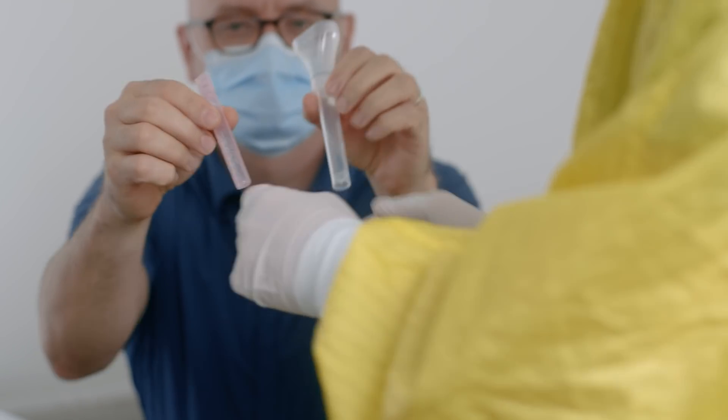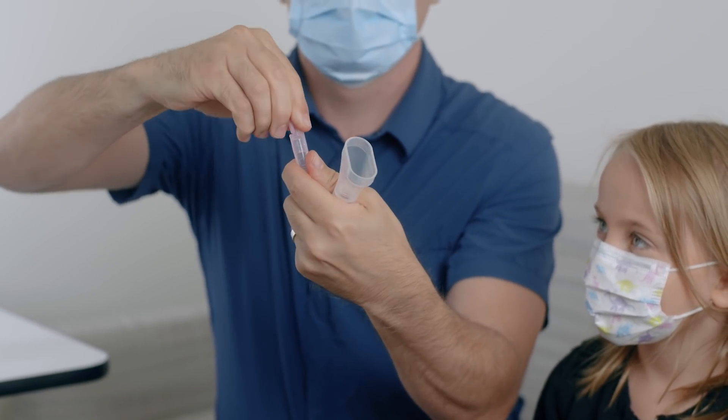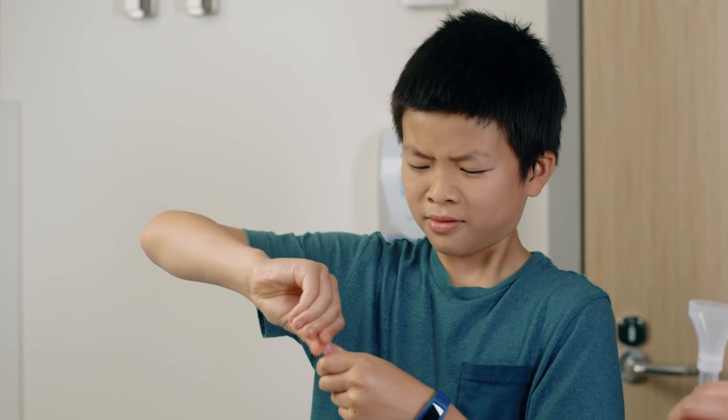Your health care provider will hand you a salt water vial and a container for the sample. Twist off the top of the pink vial of salty water by holding it with your thumb and finger.